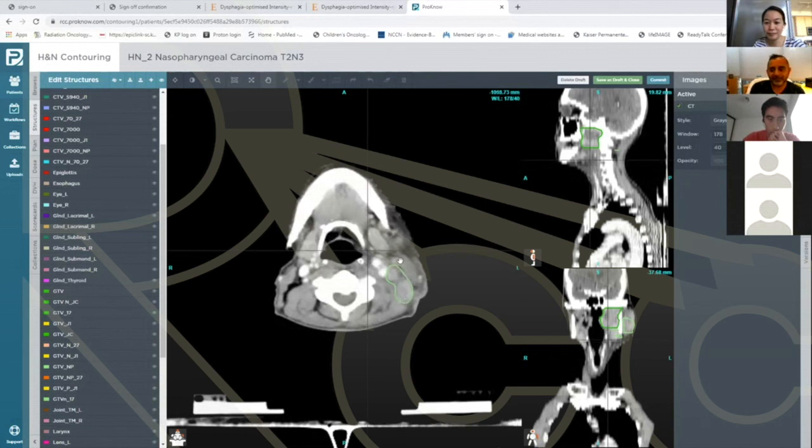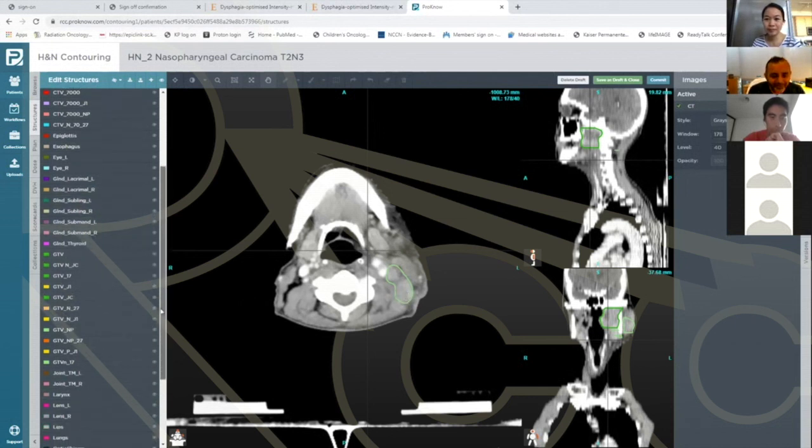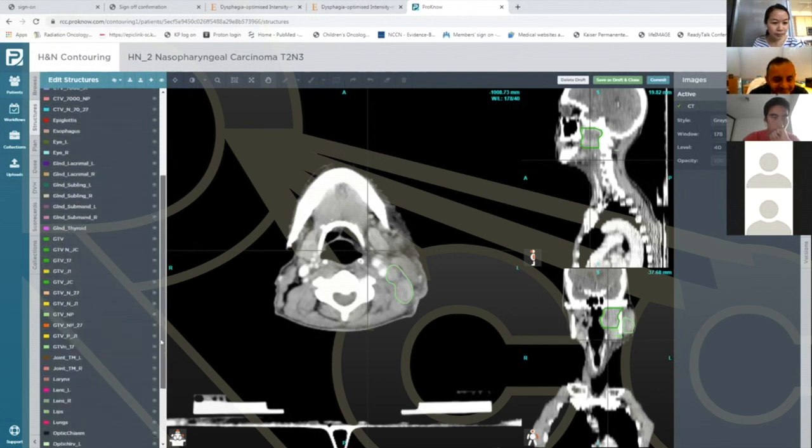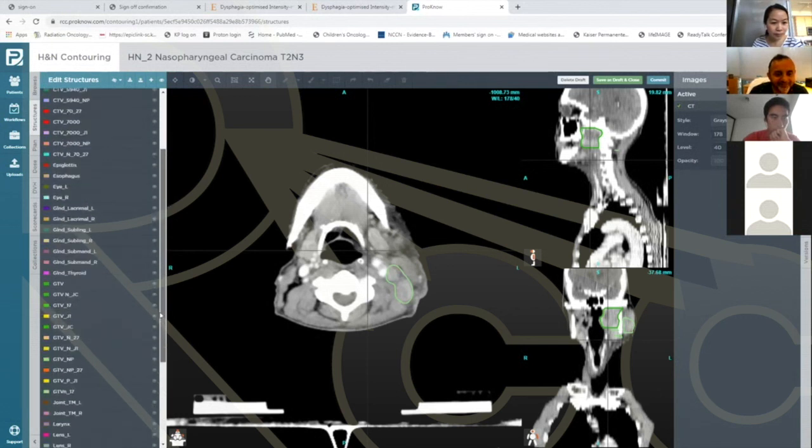And you can see, again, the sternocleidomastoid muscle, the muscle ends there. This is really that 5A node right here, 2B, 5A node right there. So great job here. And then let me see, I wanted to see if I could pull up number 17. I don't think you have the CTV volumes drawn in here, but your GTV volumes look good.